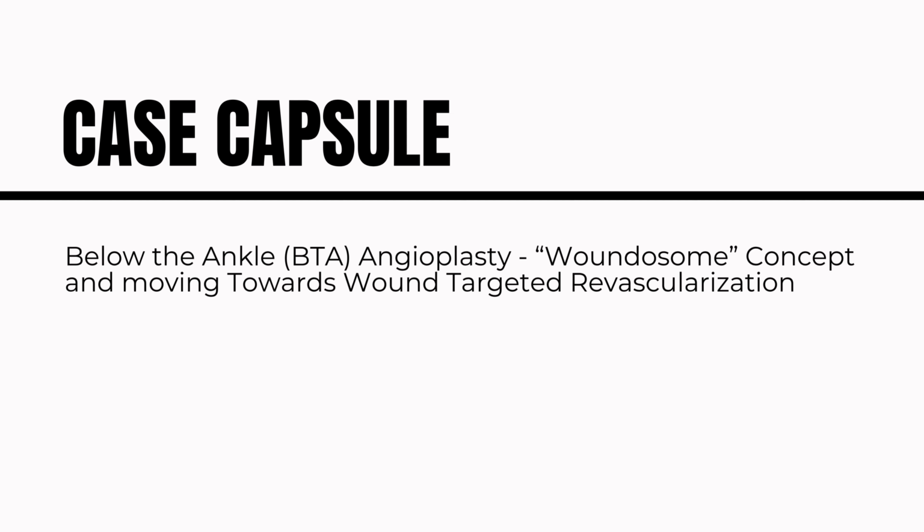So as more and more clinical evidence is being generated, we've now started moving towards below the ankle angioplasty. And this is more so in terms with the Woundosome concept. And we've started moving towards more wound targeted revascularization. So this case is to highlight the same concept.